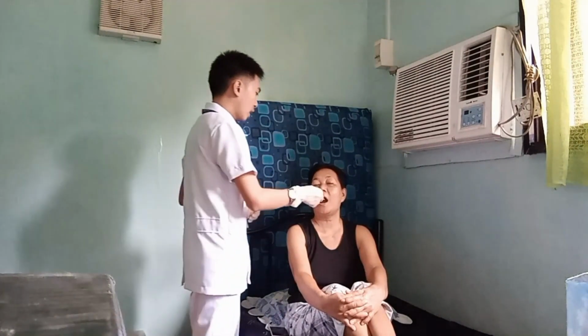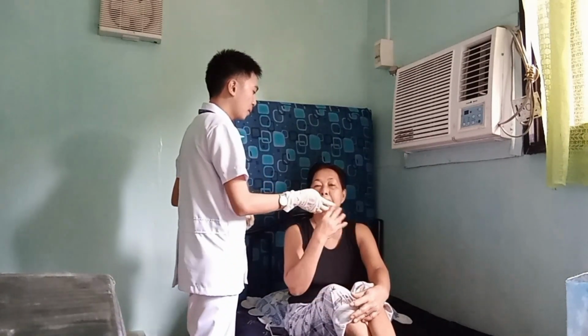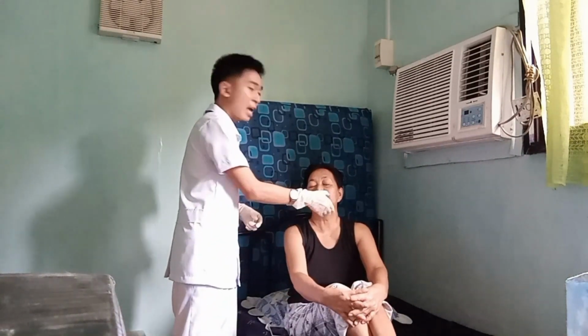So, please place the client appropriately and get the thermometer using the alcohol swab, in a firm swab motion from tip, stem to probe. So place the thermometer now, and I'm going to perform the oral method. Place the tip of the thermometer in the side of the frenulum. So ma'am, can you open your mouth and then close it and kindly hold the thermometer? And do not forget to turn on the thermometer and wait for the appropriate amount of time after its placement, so the electronic thermometer indicates a completed reading with a light or tone.